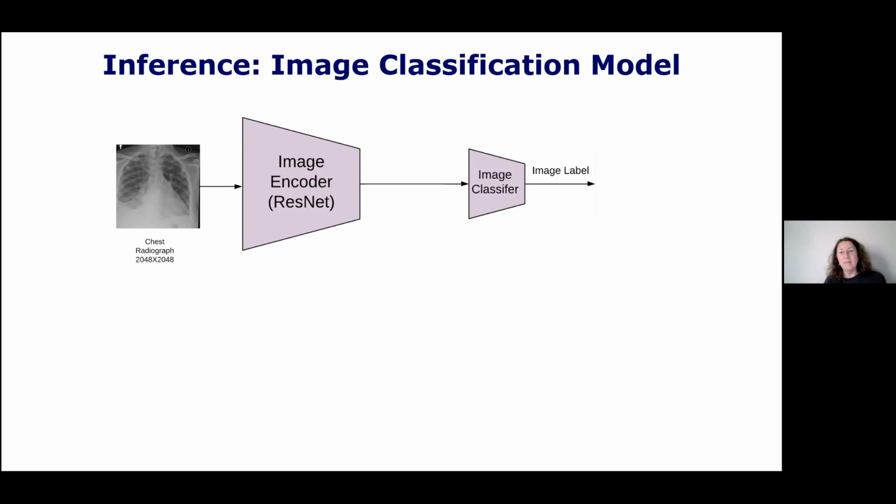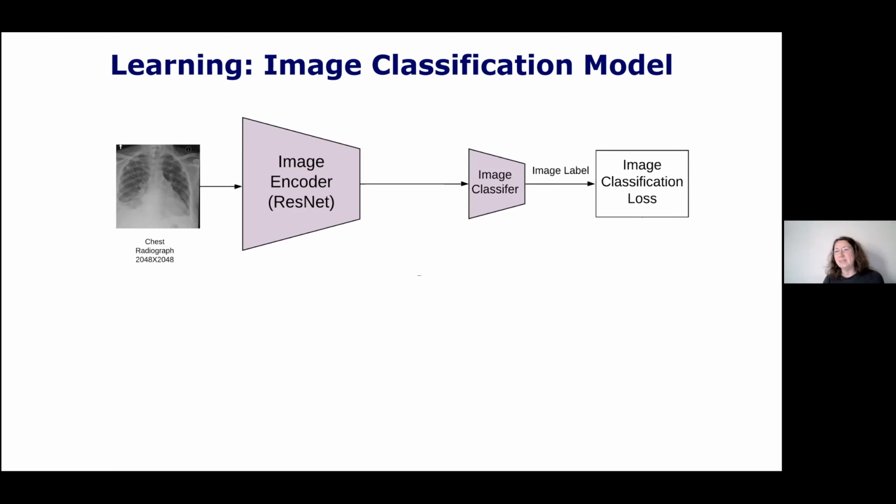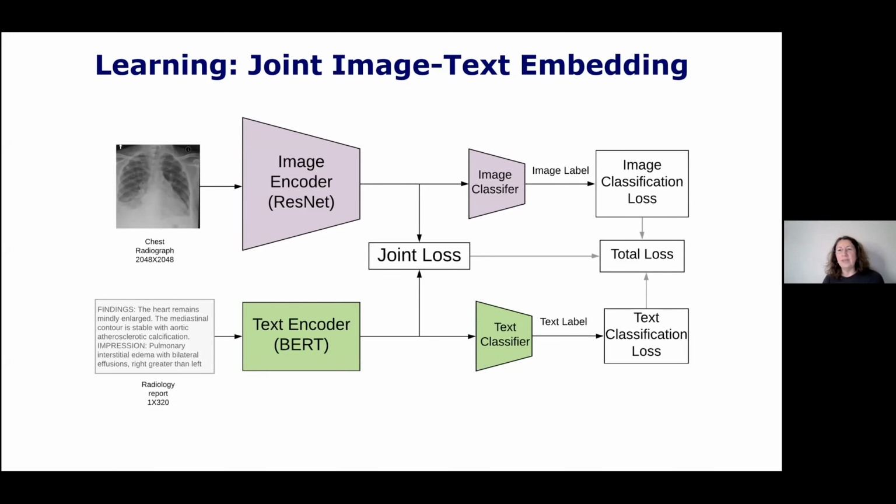So let's see. I have my classifier, and I'll split it apart into the encoder part and the classifier. And the classifier takes an output of the encoder. So you can think of it as an intermediate layer representation and builds the classification model. And typically, this is classical classification using deep nets. We will have a loss function that penalizes errors, and by adjusting the parameters of the classifier to minimize the loss, we hope to get good accuracy. And as I said, we've discovered that this is not good enough. So here's the architecture that we actually ended up implementing.